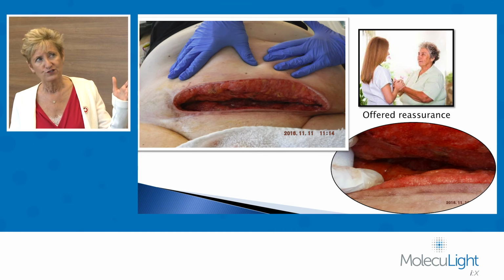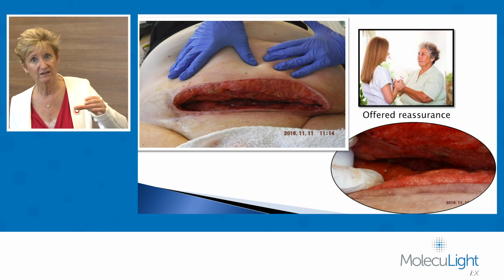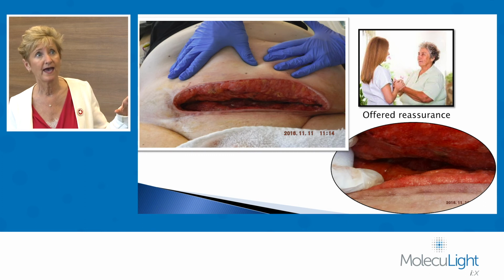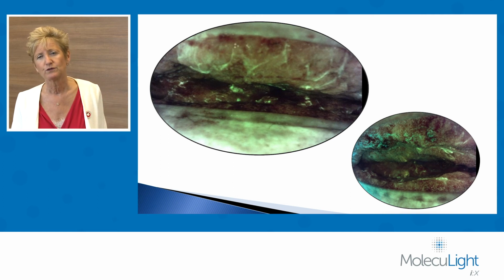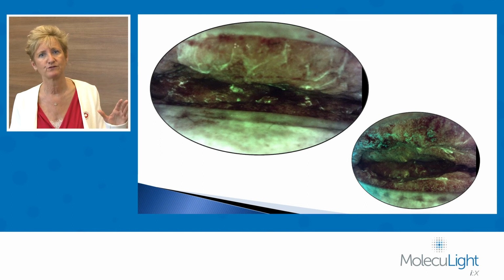So we would do that, and it was a fairly large area, so I would just carefully walk my MolecuLight 10 centimeters away, just over the wound bed, and show her the images. In the early days, because of her anxiety with her wound, in the first dressing change, we actually, at her request, she would request Ativan. And after showing her the images, she said, "You have no idea how much reassurance that offers me."